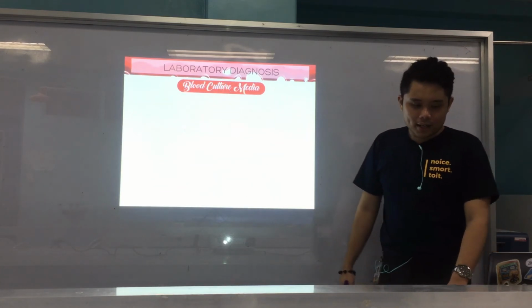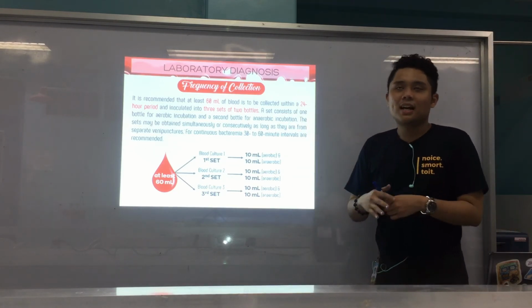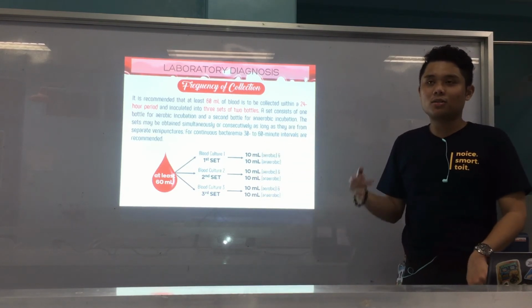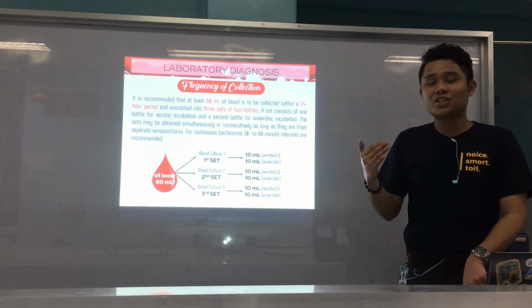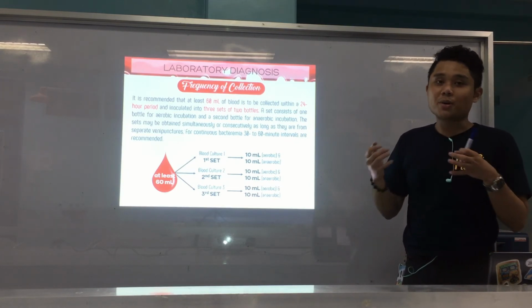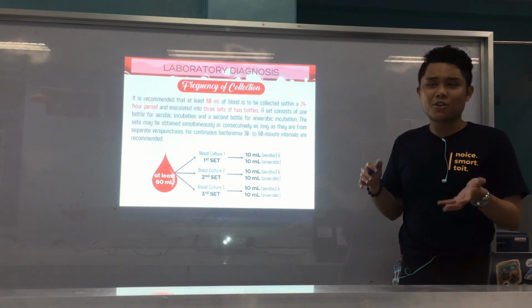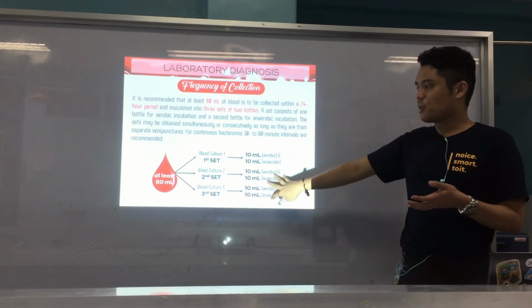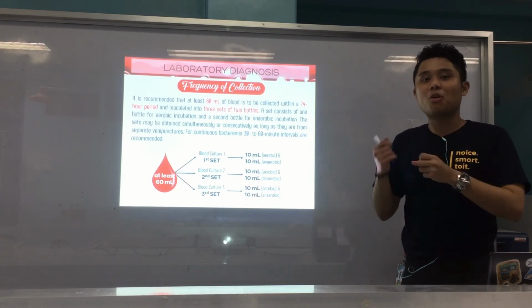Alright. Okay. Now, again, it's not so much na palagi tang mag-collect kay dito na ito makita. It's much more on the fact that the greater the volume natong makuha, bahala kanus-a or unsa atong interval, but at least the greater the volume, again, the higher chances of isolating the pathogen. Kay again, ubay-ubay man imong volume na nakuha. All right? Okay. Kay example transient, not all the time naa gyud ang bacteria. So at least kung naka intervals na gi-follow niya and with that volume na makuha each collection, then in a way, naa jud chance na pwede jud makuha ang kagaw.